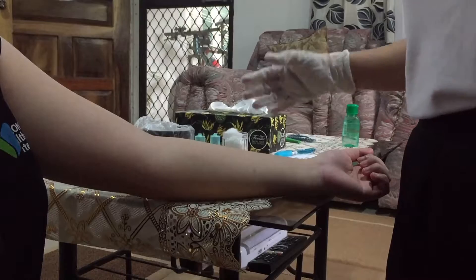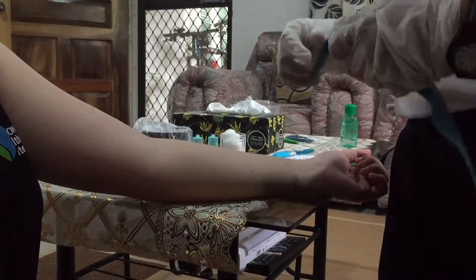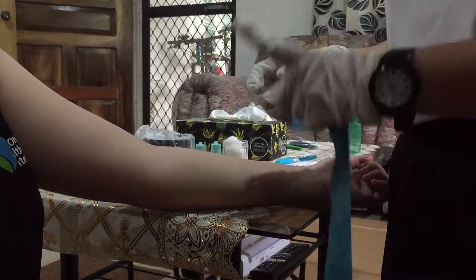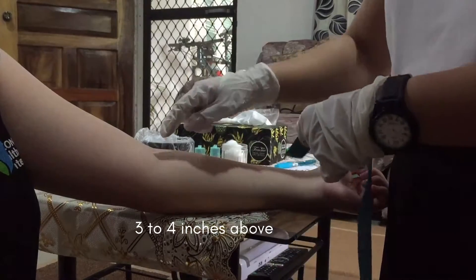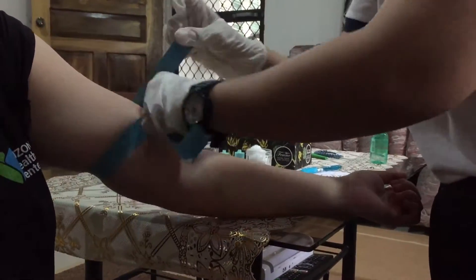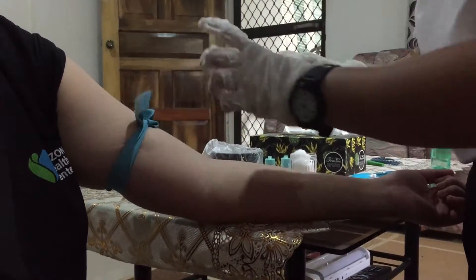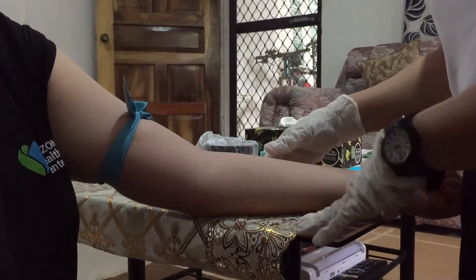As you can see, I've already prepared my things here. The first step is to apply your tourniquet. It should be applied within one minute and then two to three inches above the antecubital fossa. And then next, you have to palpate for the vein.